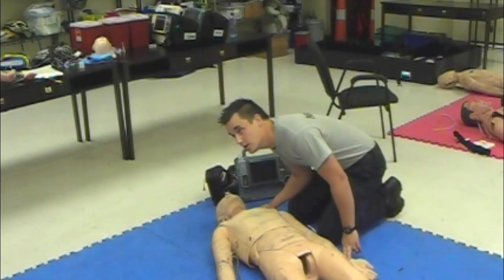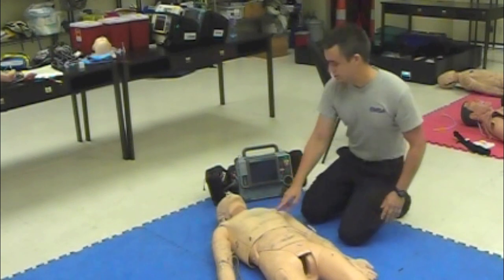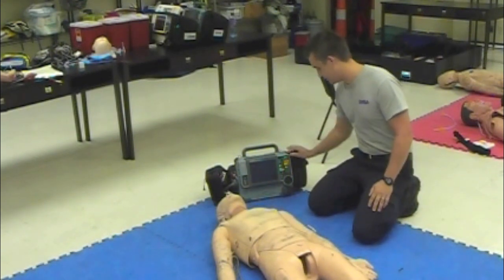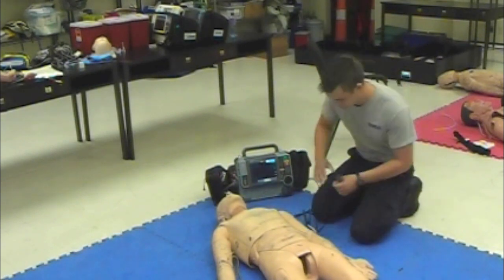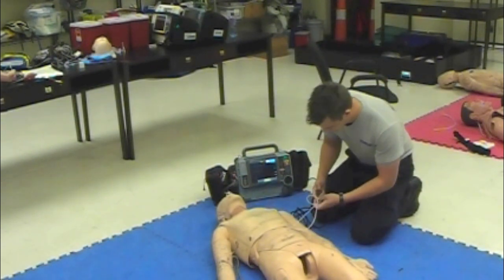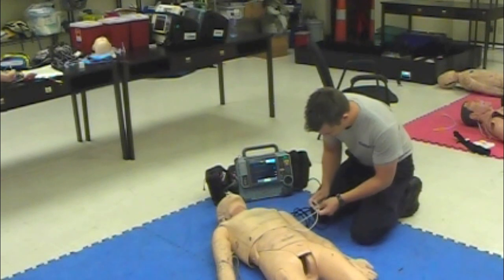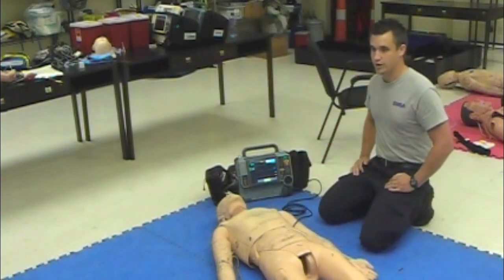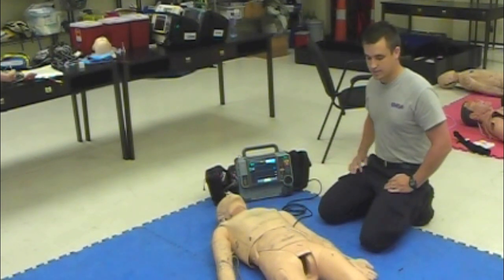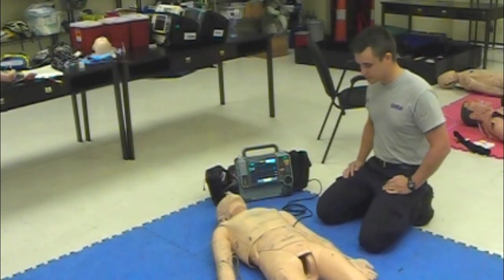Does he have a pulse? No pulse. I'm going to have my other partners begin chest compressions. I'm going to hook him up to the monitor, okay, with my fast patches. And I'm going to get all my stuff ready out for IO access and intubation in this 2 minutes.